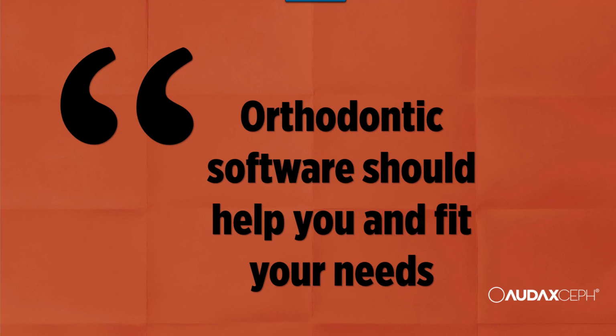If not, you just spend a little money. Software should be modern, with modern user interface gestures, exports and other deliverables, automatic tasks, etc. It should be easy to use. It should have a steep learning curve. Of course, there is always a battle between complexity and functionality. The more functionality, the more complex the software is, but basic functionalities should be intuitive. Again, if the software is scalable, you'll be able to start quickly.